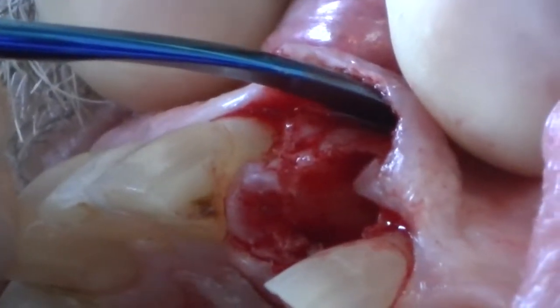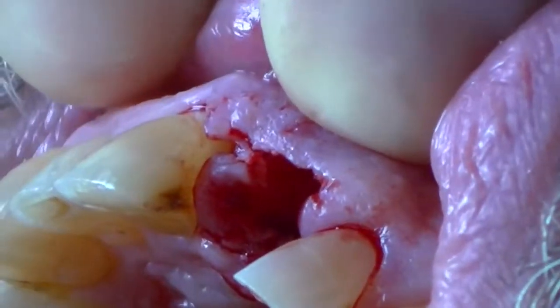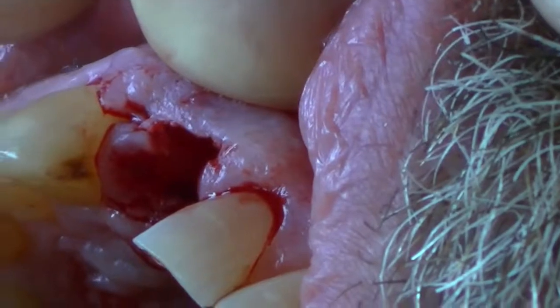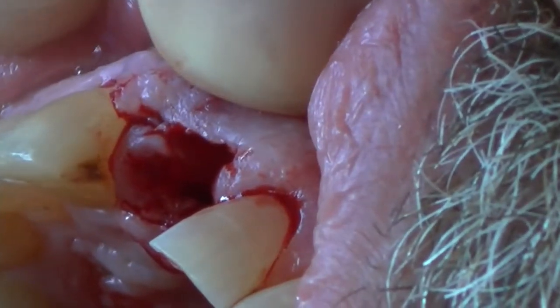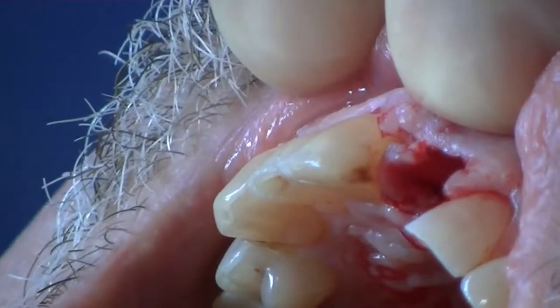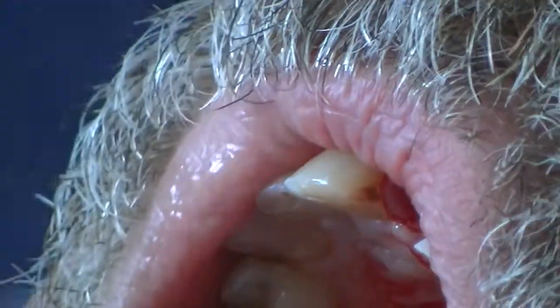There's a facial plate. So what we're going to do is go ahead and place our implant, but now I have complete control. I can actually see that facial plate. It's intact. I hope everybody's clapping right now. We will do our osteotomy, 3 millimeters palatal to the facial aspect, engaging the palatal wall, and we will place the implant, but graft the site first and then thread right into the edentulous site. How's our patient doing? Okay?